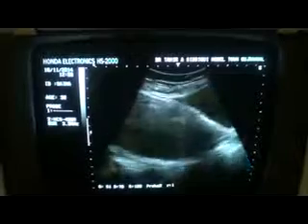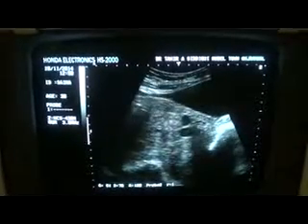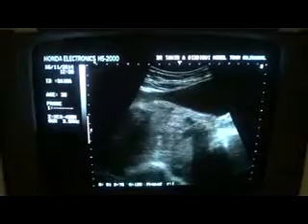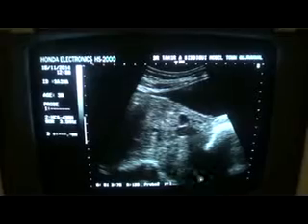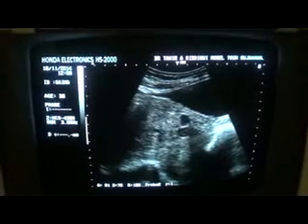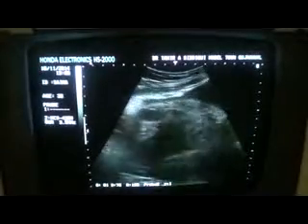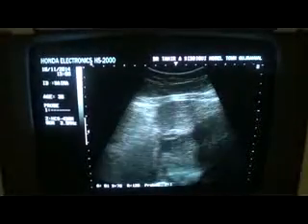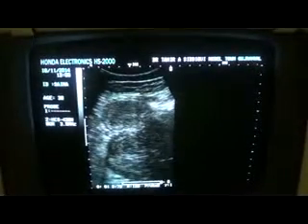And when I align the uterus with the vagina, you can see it relating to the posterior lip of the cervix, which extends again posteriorly. You see this is extension of the fibroid posterior-inferiorly in a patient aged 38 years.